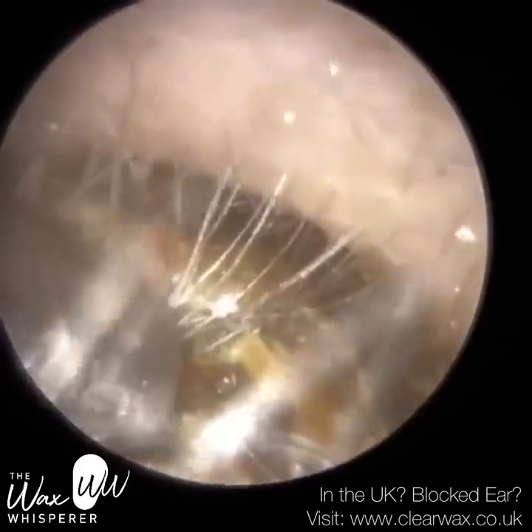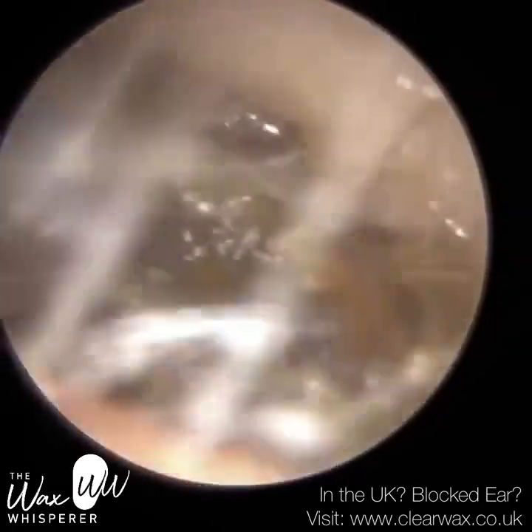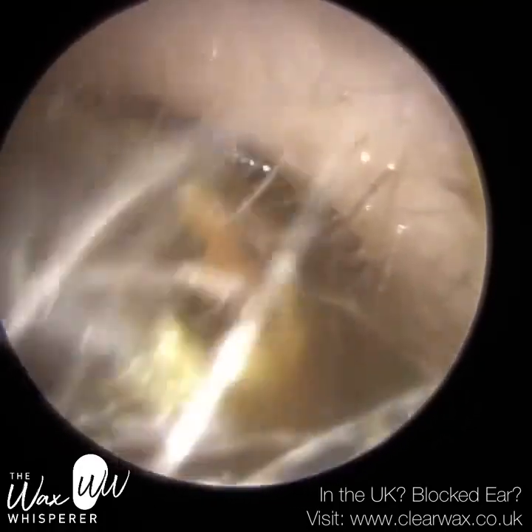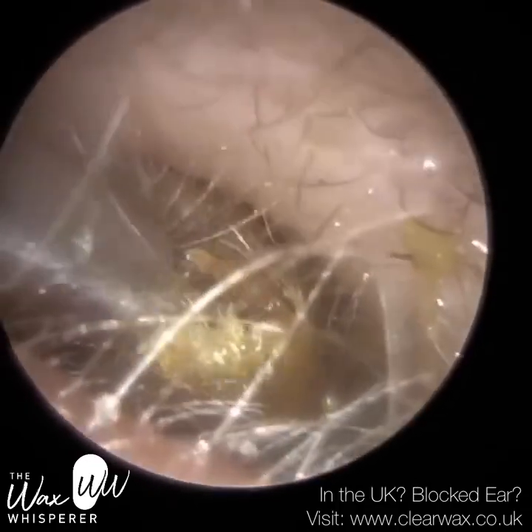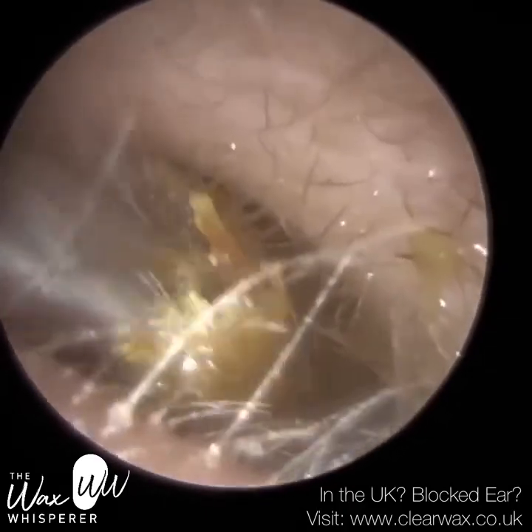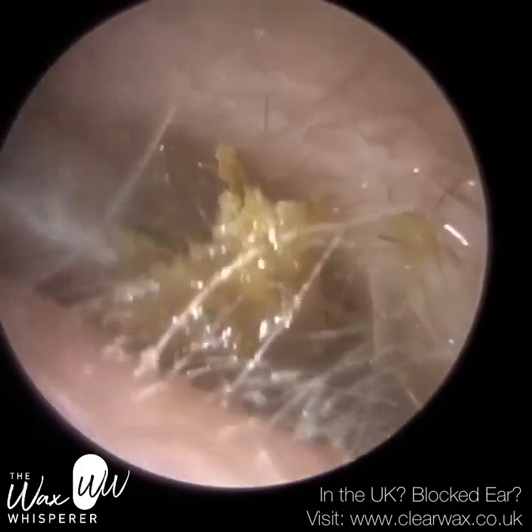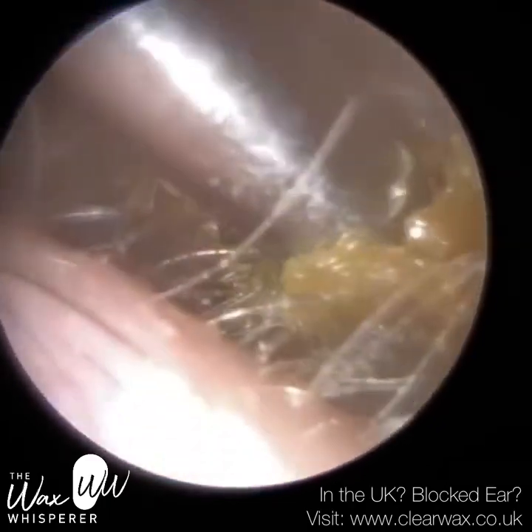and then about 1/2 centimetre into the ear canal where the first bend is, the ear canal narrows up to the second bend, which is about a further 1/2 centimetre or centimetre past. So that's a narrowing. Then the ear canal widens again, and then once more as it arrives towards the eardrum about 1/2 centimetre away, it can narrow. So you can see the anatomy of the ear can vary immensely, not only from individual to individual, but between ears. So your right and left ear, similar to our feet, I suspect, there can be big differences.